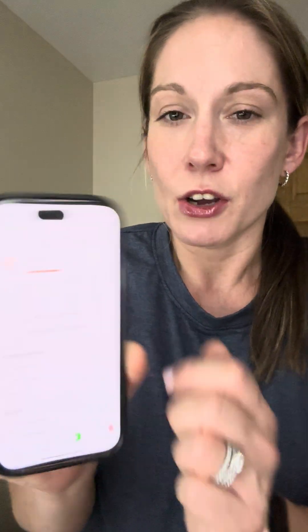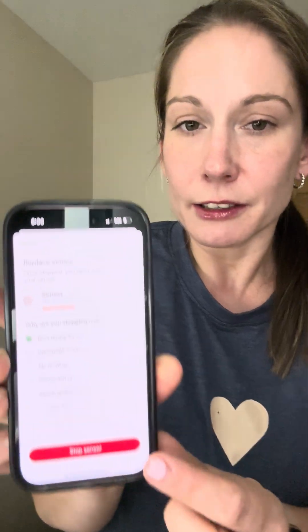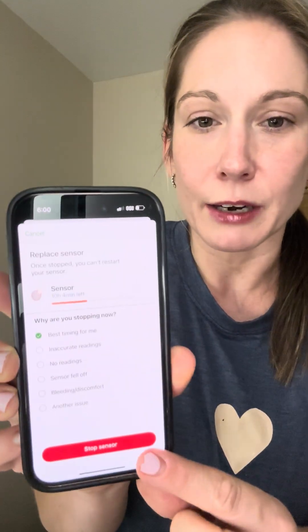You can see my sensor has 10 hours left and I'm going to hit 'Replace Sensor' on the app. There we go — hit the red button at the bottom that says 'Stop Sensor.' Now it's prompting me to remove my sensor, so I'm going to remove that. My sensor has now been removed, and I'm free to toss this into the trash.